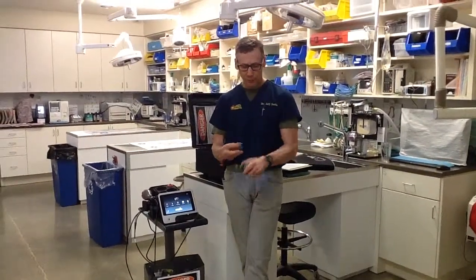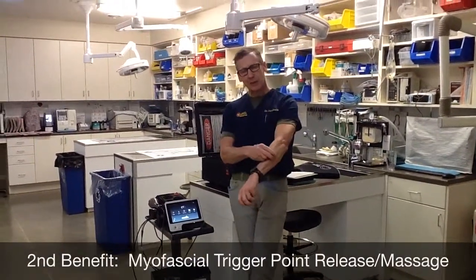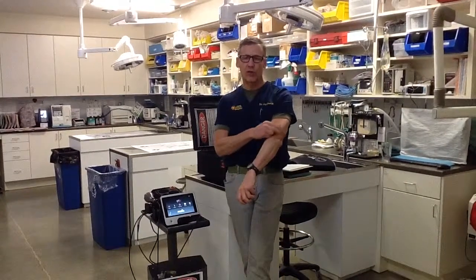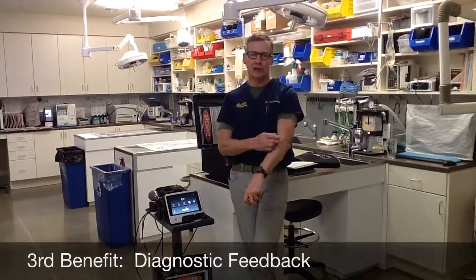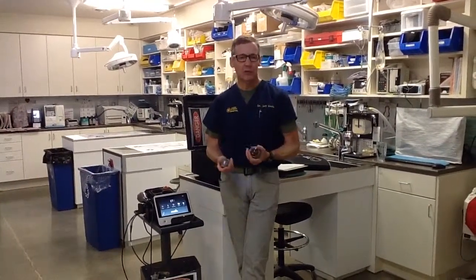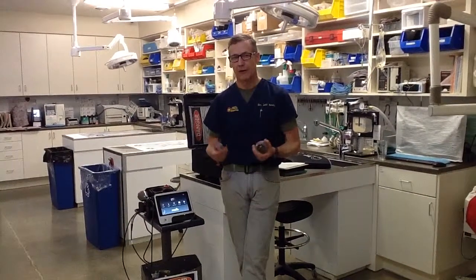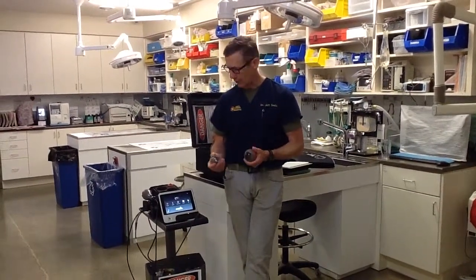You also get a myofascial trigger point release when you're doing this, so you get a second therapeutic benefit. A third level of expertise — and this probably takes a hundred times of doing it — is to diagnose what's happening with the patient: how sensitive or painful they are in that area, or how good it feels. Like when getting a massage and somebody hits that sensitive spot — 'right there, that's the spot.' Animals will do the exact same thing, but it does take an enhanced level of expertise.